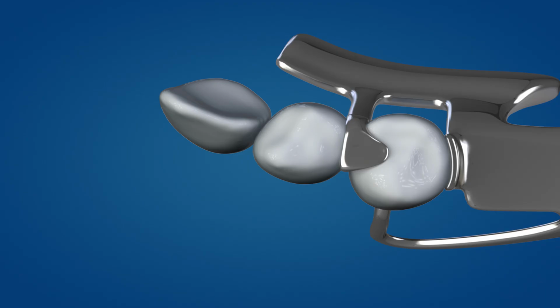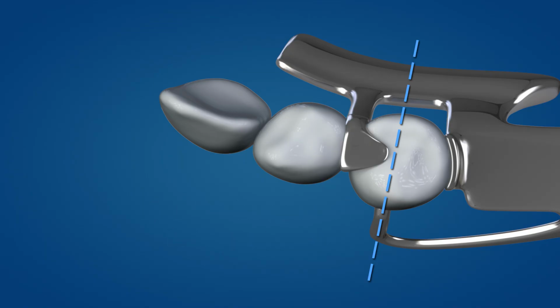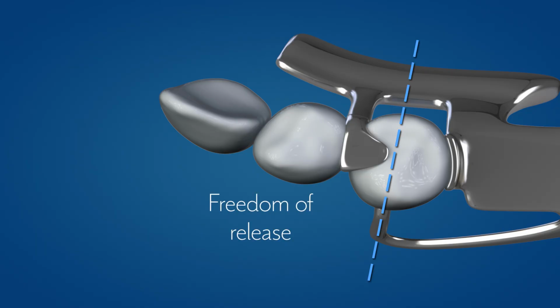Facial contours of the abutment also warrant our attention, as these contours must be considered in clasp placement. When viewed from an occlusal perspective, the abutment will exhibit a facial prominence. It is essential to recognize the retentive terminus of the infrabulge clasp must be located at or mesial to this prominence. This placement permits the retentive arm to disengage from the tooth during occlusal loading.